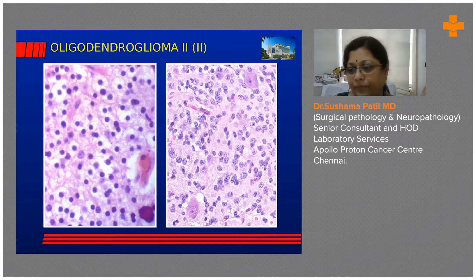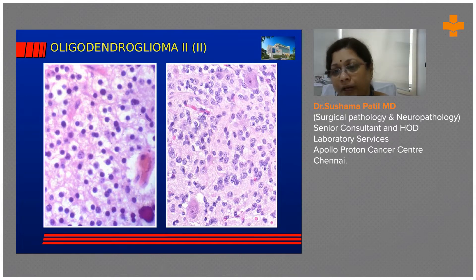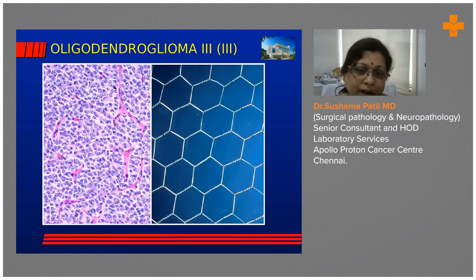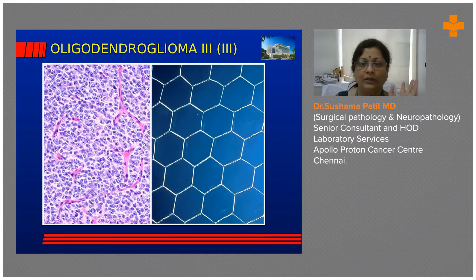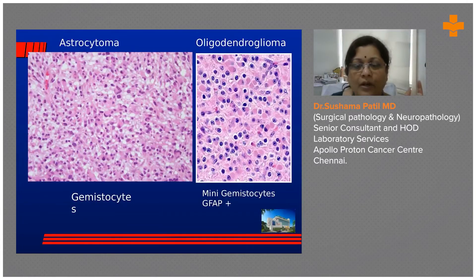Here is the gross histology. On the left-hand panel you can see the classical round-looking nuclei with a clear space around them — what we call the fried egg appearance. On the right-hand side there are two large cells, one at each corner, which are neurons telling us this tumor has invaded the cortex. The left-hand panel also shows delicate Y-shaped capillary structures mimicking chicken wire — that is why we call it the chicken wire capillary vasculature in oligodendroglioma.